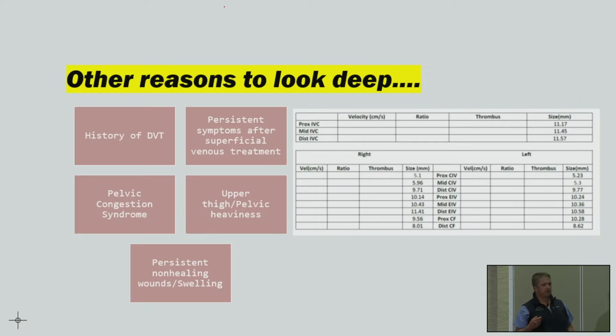And I think somebody here has a lecture on the iliac venous ultrasounds later, but I think they've revolutionized the way we look at these patients and heightened our index of suspicion. So again, she had persistent symptoms after superficial vein treatment.